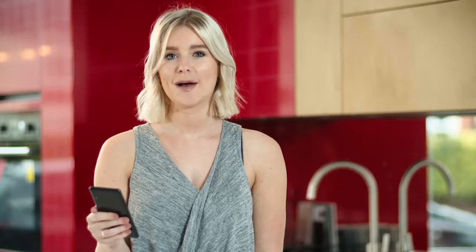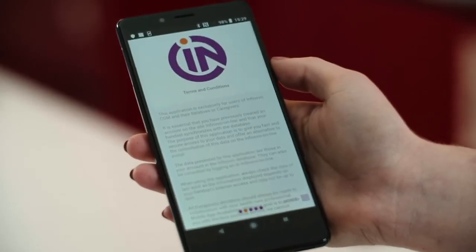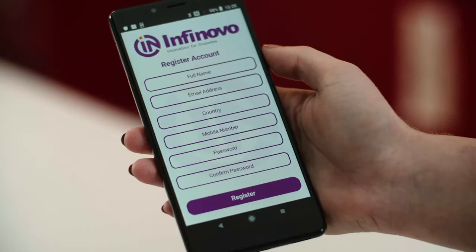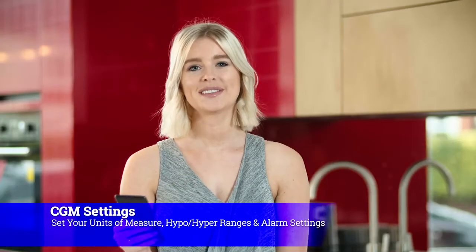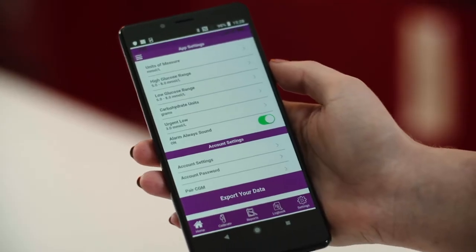On the first launch of the app, you'll need to read the terms and conditions and tick the box to approve them. First of all, you'll need to enter your details — this is used by the app's export data function. Once you have entered your details, the app will take you to the setup screen, where you will set up your units of measure, hyper and hypo ranges, and alarm settings. As a safety feature, urgent low alarms cannot be muted. Then you will be requested to apply the sensor to your preferred location — I put mine on my abdomen.